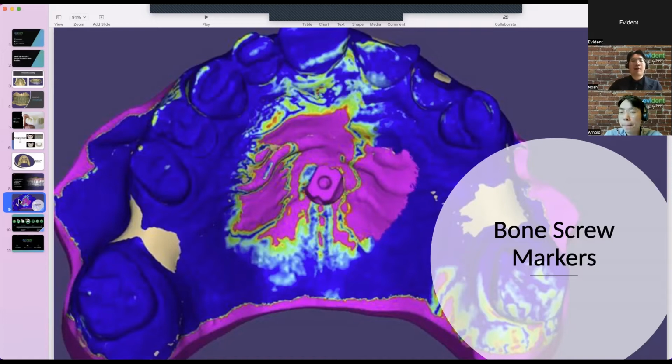Good point. And if you think about your time as a clinician, that's an hour that you're spending in your office on a computer rather than seeing patients, presenting cases, or doing actual treatments. And that's per arch. So aside from the scanner and a design partner, if you do want to go through photogrammetry, it's an amazing piece of technology.